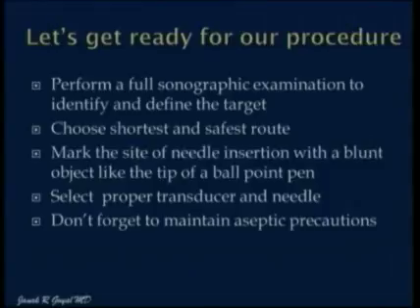But before I begin, you must perform a full sonographic examination to identify and define your target and choose the shortest and the safest route. Mark the site of needle insertion with a blunt object like the tip of a ballpoint pen. Select a proper transducer and needle, and do not forget to maintain aseptic precautions.